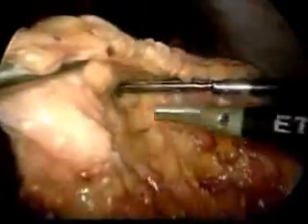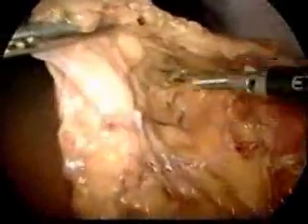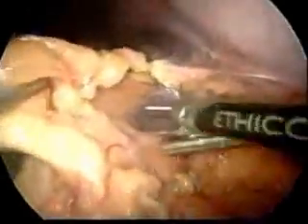As the dissection proceeds, care must be taken not to injure the right or left gastroepiploic artery, depending on which one is to be used for the flap's blood supply. Dissection is taken to the hepatic flexure on the right and the splenic flexure on the left. Care is taken not to use excessive tension on any adhesions that may cause bleeding along the splenic capsule.